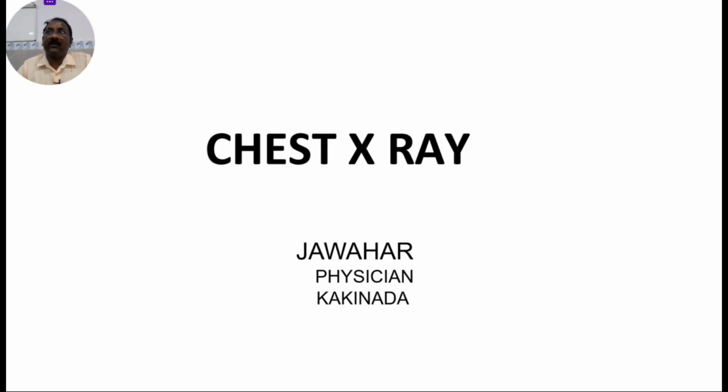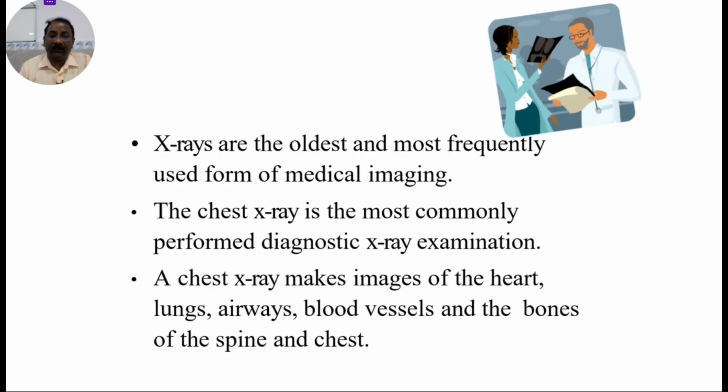So dear PTs, this is going to be one of the very important topics for our clinical practice. These are the oldest and the most frequently used form of medical imaging. This is the most commonly performed diagnostic X-ray examination. This is the chest X-ray. It makes images of not only the lungs, heart, blood vessels, but also the bones of the spine and the chest.